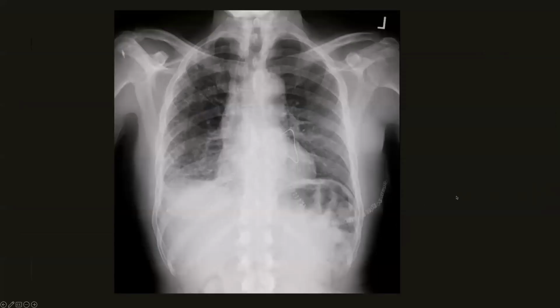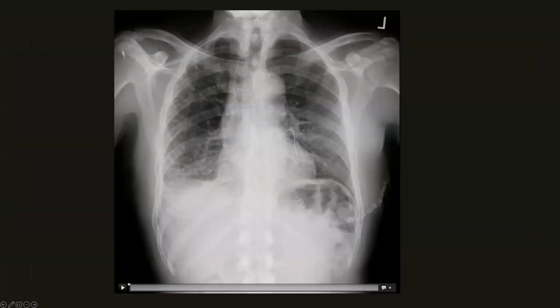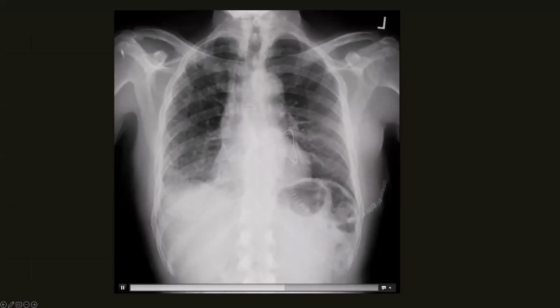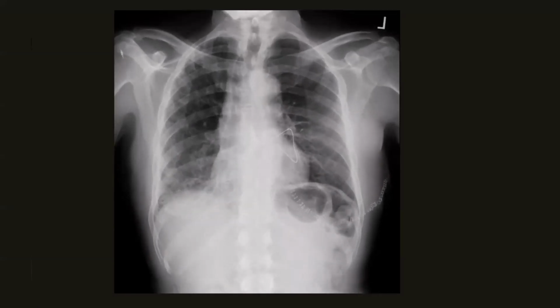And then a few weeks after the patient had his lung transplant, he came in for his first post-operative visit to the clinic, and he got this DDR performed. So you can see the transplanted left lung allograft appears fairly normal, but if you'll notice throughout the respiratory cycle, the lung motion on the left is decreased relative to the right.